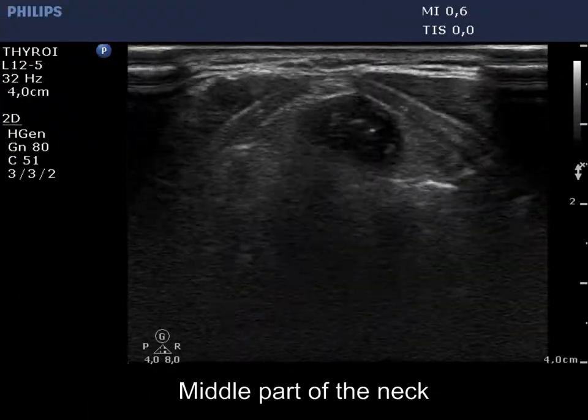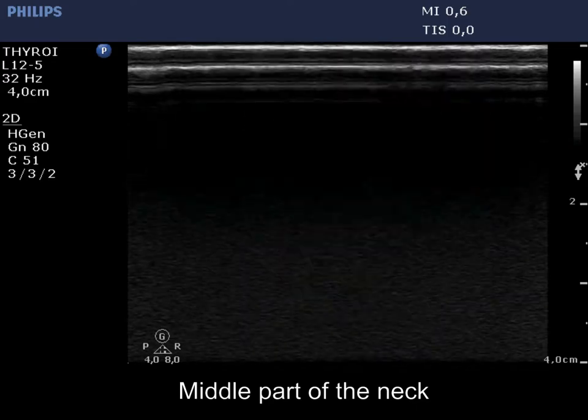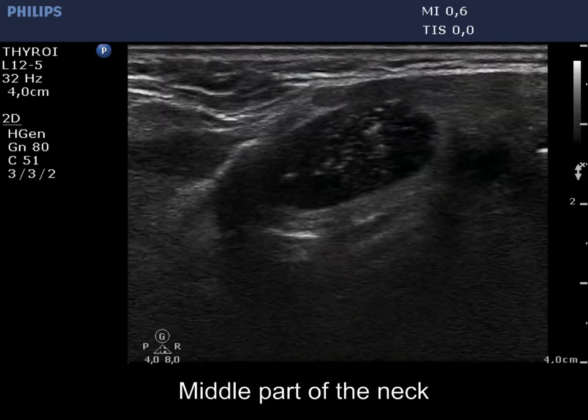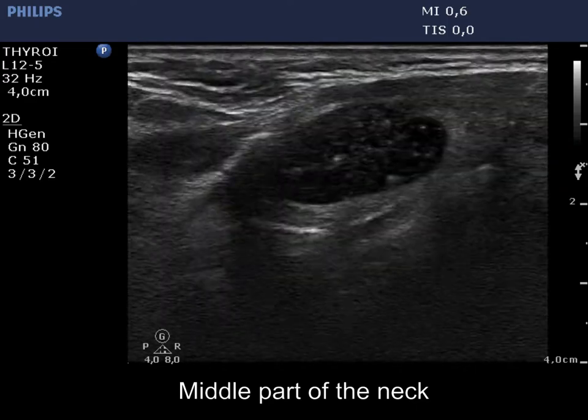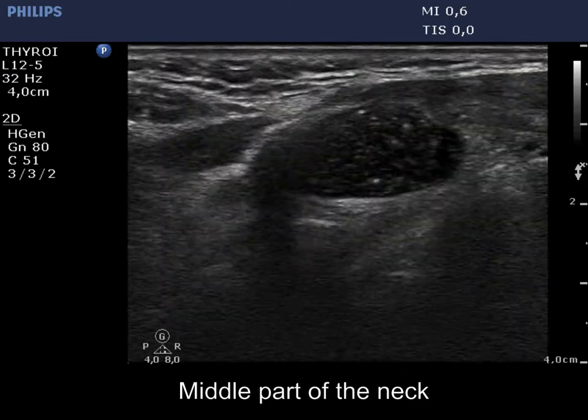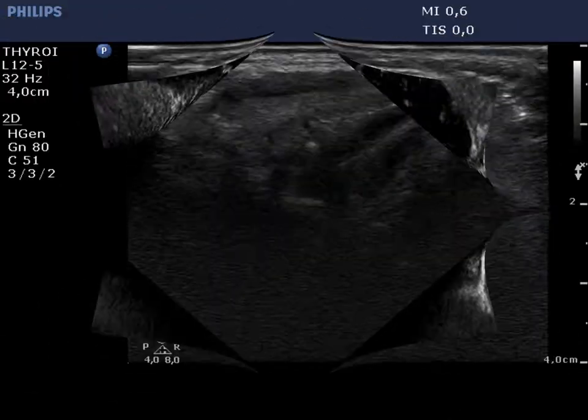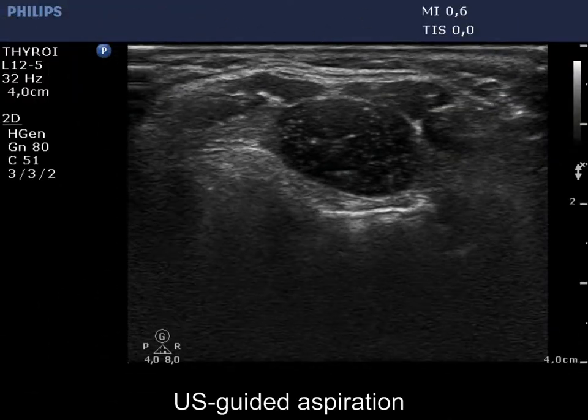There is a hypoechoic, inhomogeneous mass several centimeters above the thyroid. The lesion has echogenic granules, sharp and regular borders.